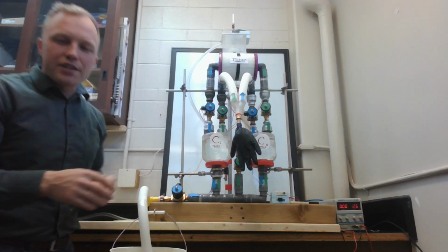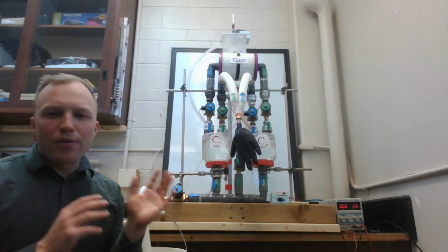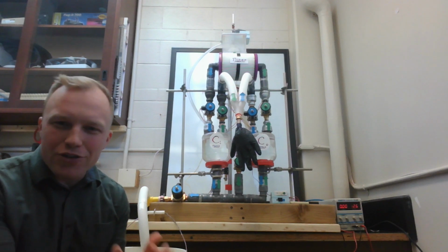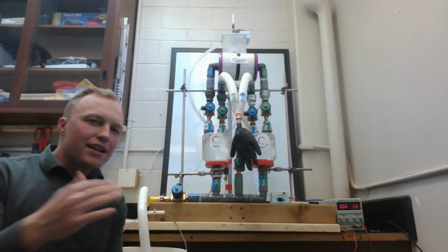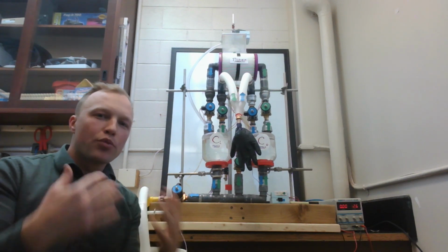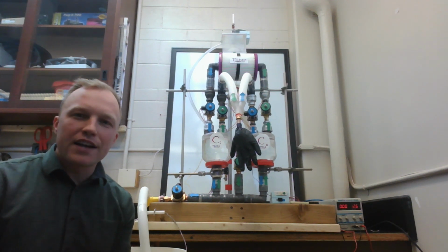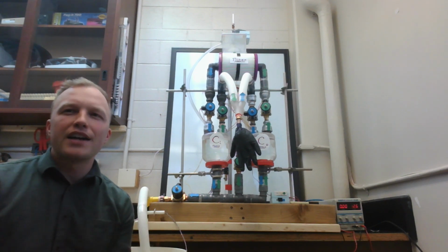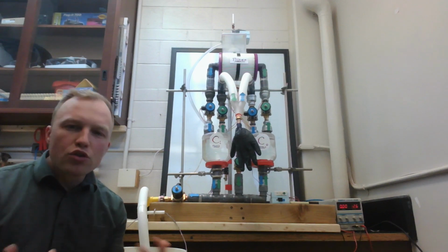So this fluid system is a simple mechanism, costs about $300 to build, and it provides some of the essential mechanics of ventilation. So I'm hoping that I can collaborate and turn this into an open source project and find a way to improve the design and make it so that we can build a very cost-effective, easy to build, easy to fix, or easy to even improvise, lightweight solution to what has become a global challenge.